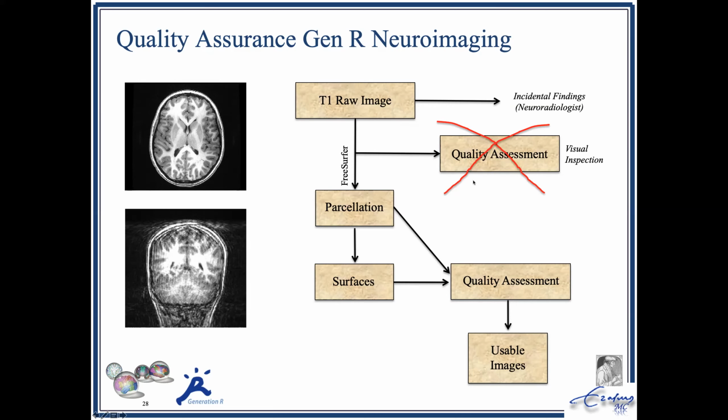I actually have another question, and this may be a really dumb question, but why is FreeSurfer being used as a technique for quality assurance or QCing? Oh, no, we just run FreeSurfer, but we want to make sure that the quality of the FreeSurfer is good. So we're testing it. Oh, okay. But we're using the auto QA to assess the raw image. Okay, got it. Helping assess the raw image and whether it needs to be repeated or not.